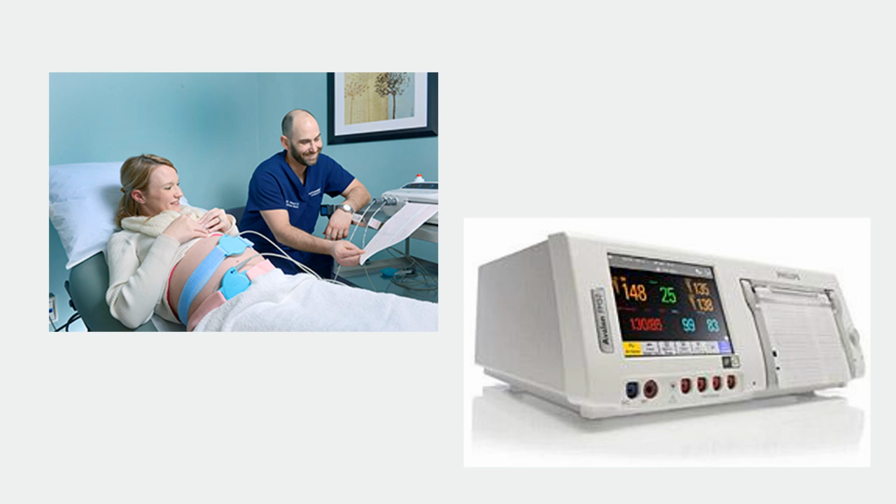Now the bottom monitor there is a fetal heart rate monitor. So we will go over in a few minutes how we determine where to place it, but generally it's going to be on the lower part of the mom's abdomen because the head is typically down there, and that's where the fetal back is. Now you find the heart rate best where the fetal back is located. And we put transducer jelly on the underside of that monitor and place it on her belly so that it can transmit the fetal heart rate signal.